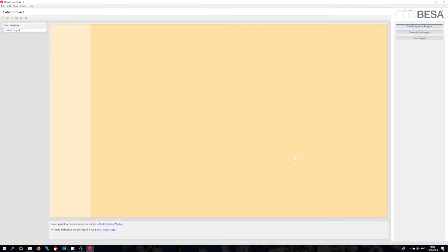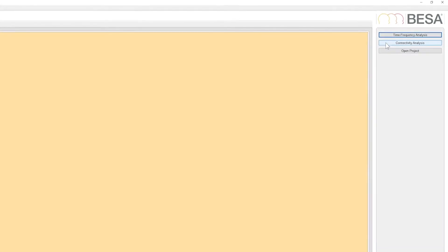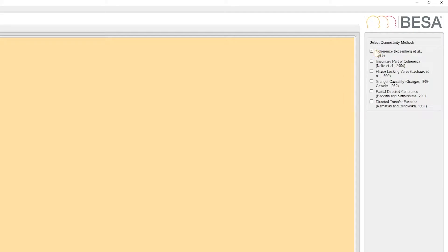Let me start the connectivity analysis. I will check out coherence, imaginary part of coherency, Granger causality, and partial directed coherence.